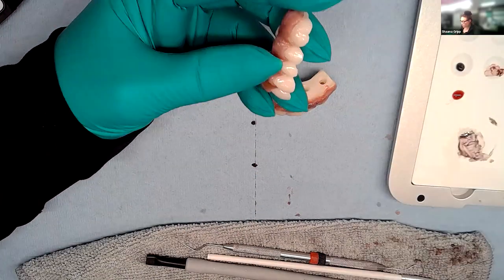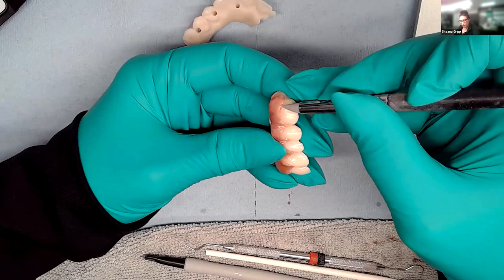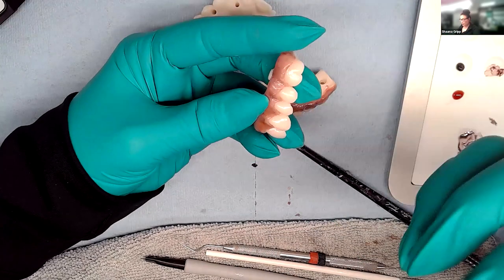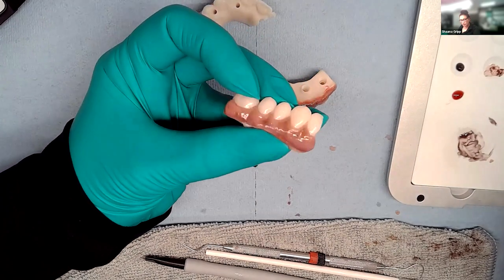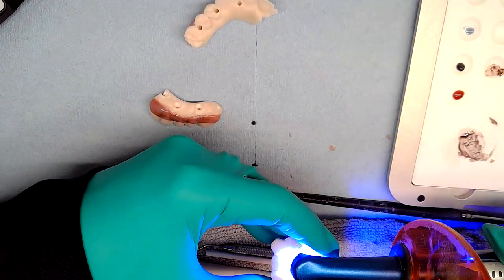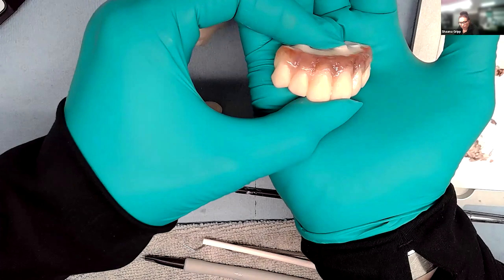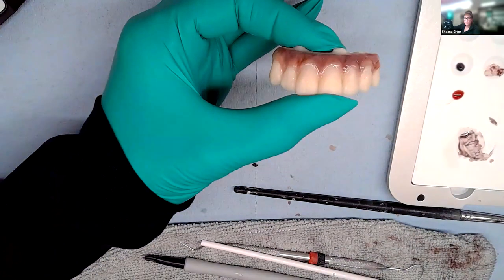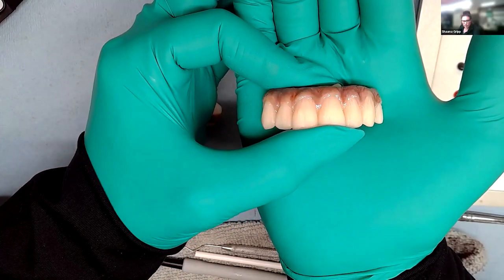If she does use glaze, she'll paint it on very lightly just to seal the margin, blow some air to even it out, and cure it so it's not chunky. She holds the finished piece close to the camera — beautiful work. She adjusts the light bar from warm to the brighter setting so the shade shows more accurately on camera. Thank you so much, Shanna.